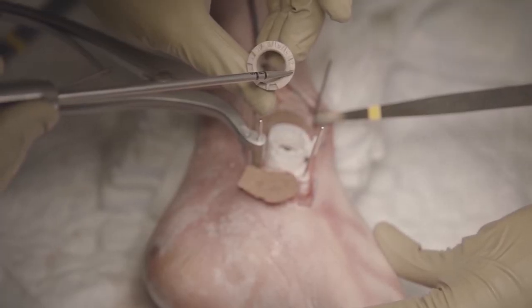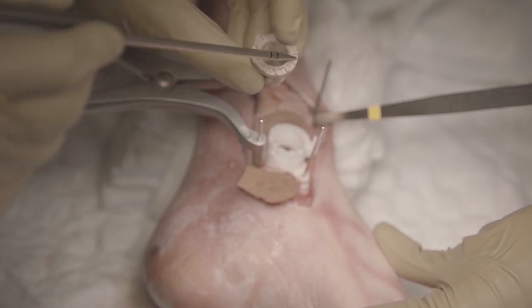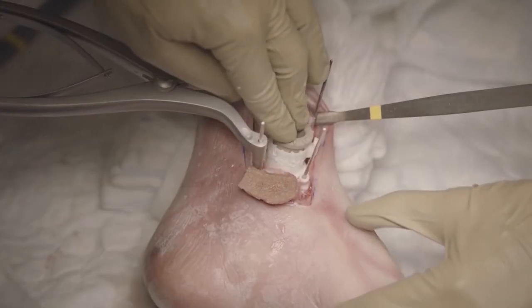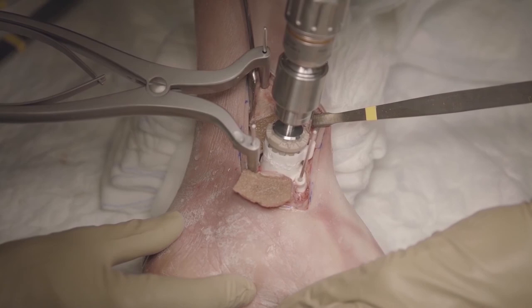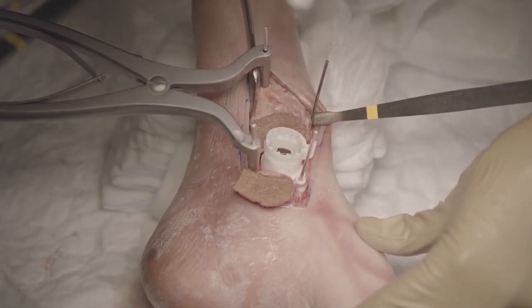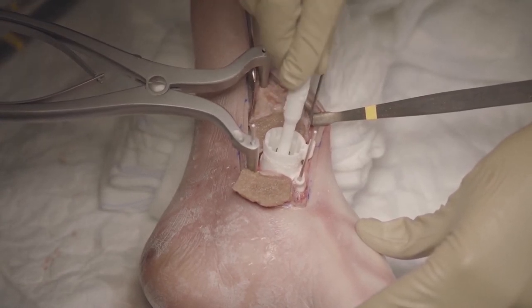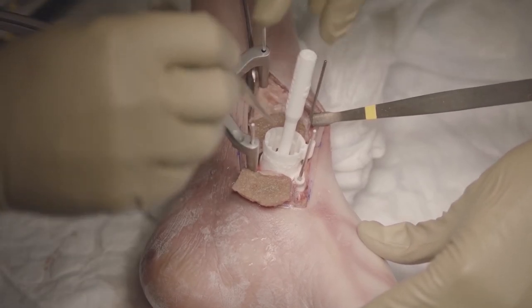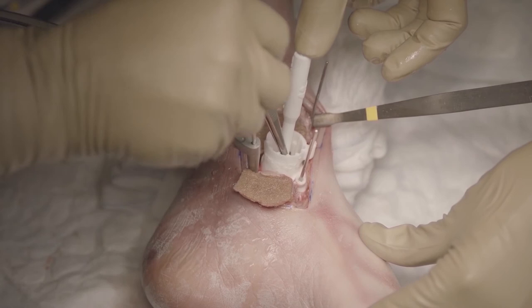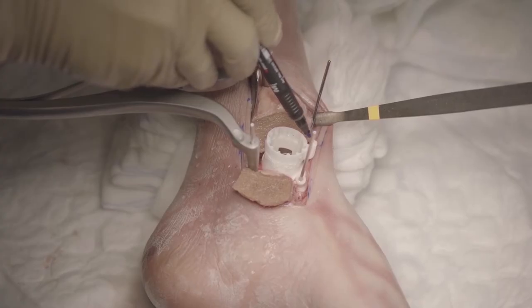We can have a 0.2, 0.4, or 0.6 mm depth in relation to the cartilage. In this case we choose 0.6 mm — we place it, we drill it again, and flush it in order to take away the debris. We check with the AP dummy if we are satisfied or if we have to go another 0.2 mm lower. In this case we are happy.